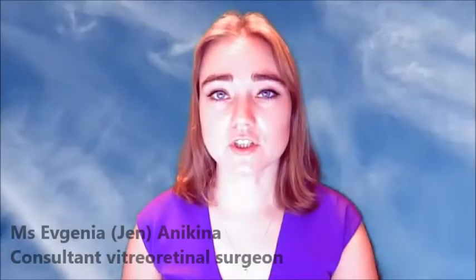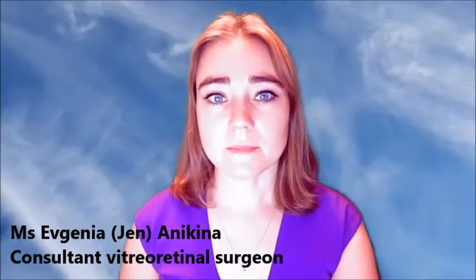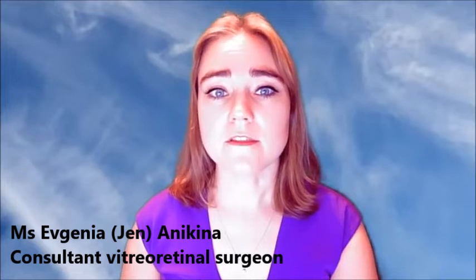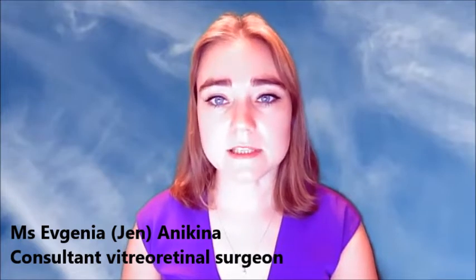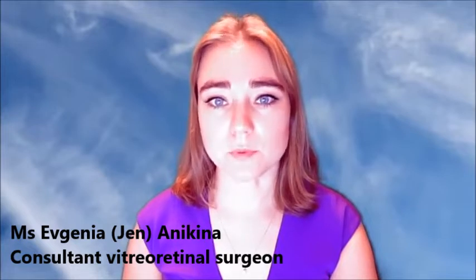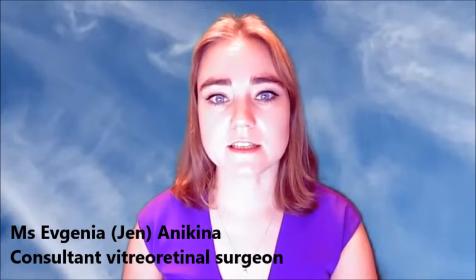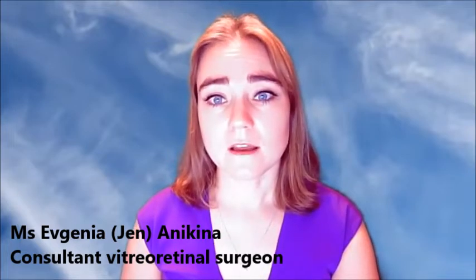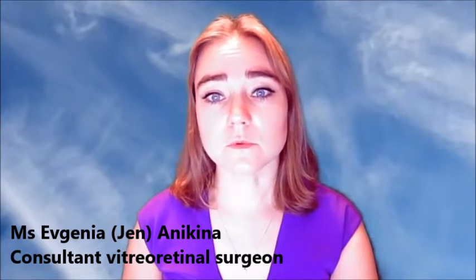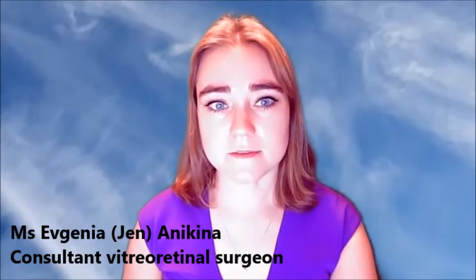There are many types of intraocular lenses in the market which are used for secondary lens surgery. The main question for your specialist to consider and discuss with you is how to ensure that the new lens implant will be nice and stable inside the eye and how it can provide the best vision with the fewest possible problems. Available implants can utilize existing support structures inside the eye, such as the capsule. They can be placed in the front chamber of the eye, or some lenses can be fixed to the wall of the eye, which is called the sclera, or the colored part of the eye, the iris.